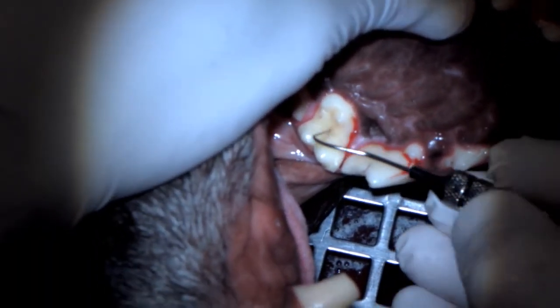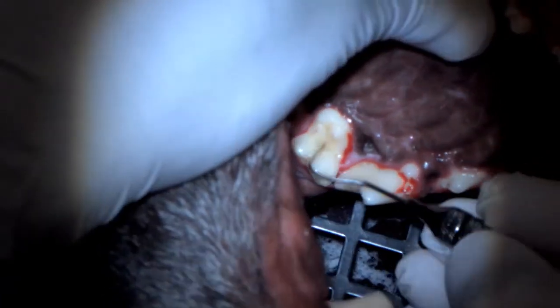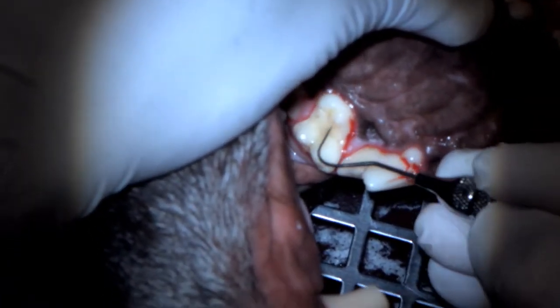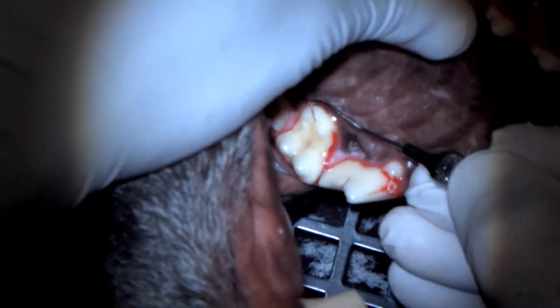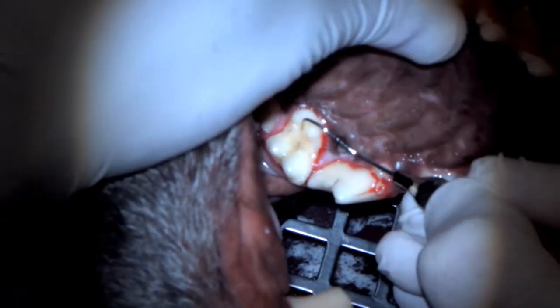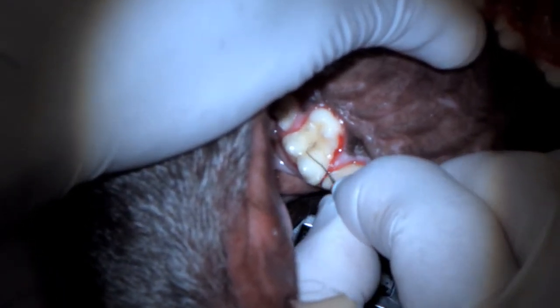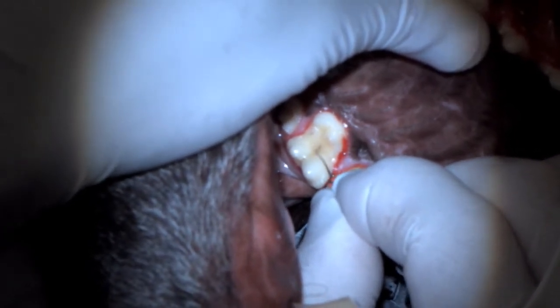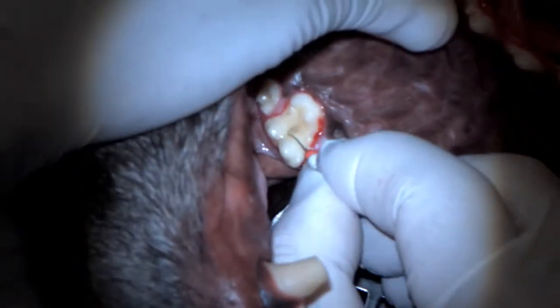What we're concerned about right now is she had bilateral caries — bacterial decay — in her maxillary first molars in these occlusal pits. I've already drilled and filled the one on the upper right, and now we're going to drill and fill this one. It doesn't look like much, but often it doesn't. There's a narrow entrance, and sometimes the defect balloons out below the surface. That little dark spot is just some staining but no decay. The hallmark was when I took a very fine instrument and stuck it in — it stuck. The dentin in there is soft. This is a number 15 endodontic file, all bent from me pushing on it, but the point is there's soft, mushy dentin in there, so we have decay.